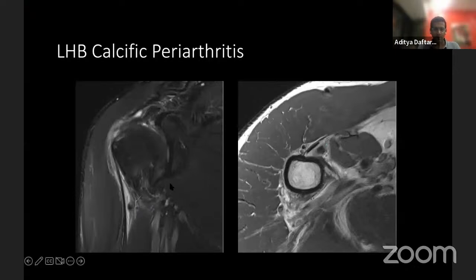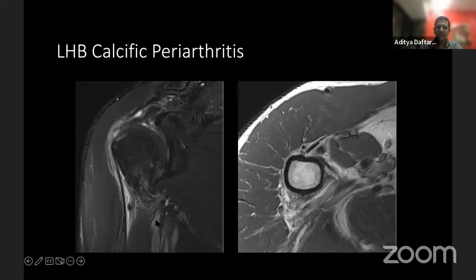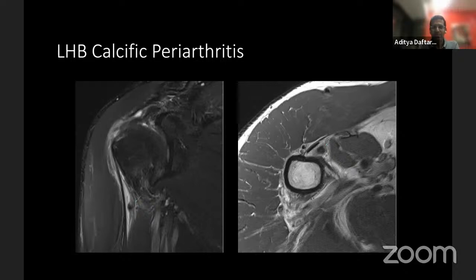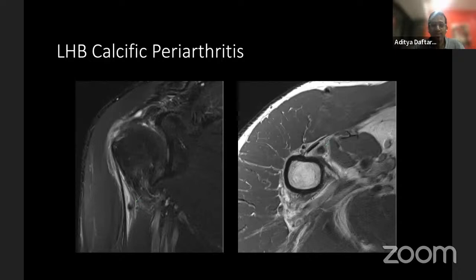Here is another example of something that can go wrong with the biceps. You see isolated fluid along the biceps tendon sheath and a tiny dark object, which turned out to be a small focus of calcific periarthritis. One has to be careful with little foci of calcification within the biceps tendon sheath because, since it communicates with the joint, you can also see intra-articular bodies from osteoarthritis trickling down. You must determine whether it's calcific periarthritis or just intra-articular debris extending in.